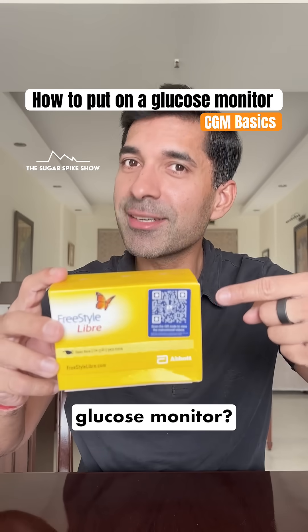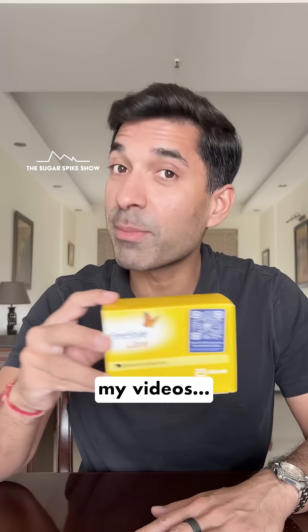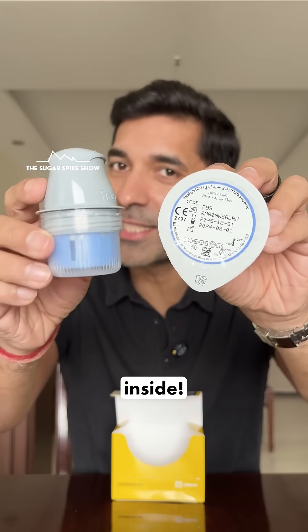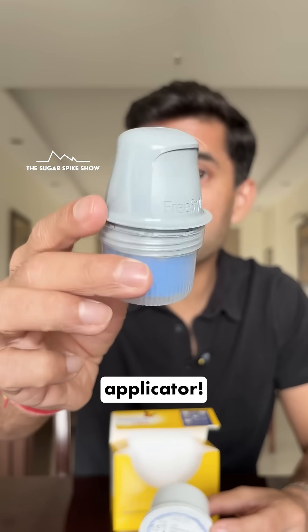Do you know how to put on a glucose monitor? Let me show you. I have been using the Freestyle Libre glucose monitor in all my videos and this is what it looks like. Once you open it, you'll find two things inside: this is the sensor and this is the sensor applicator.